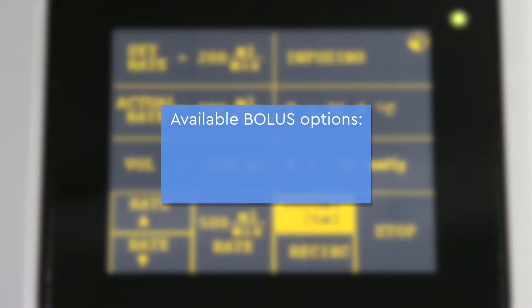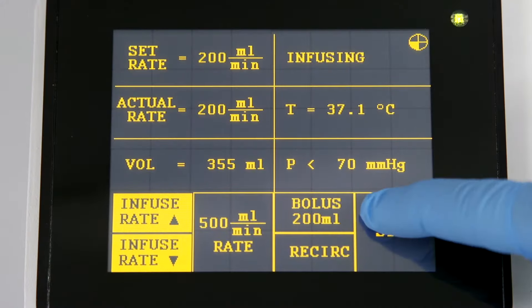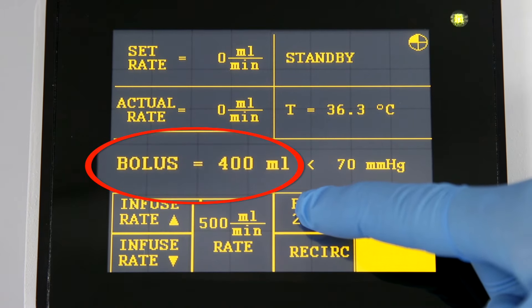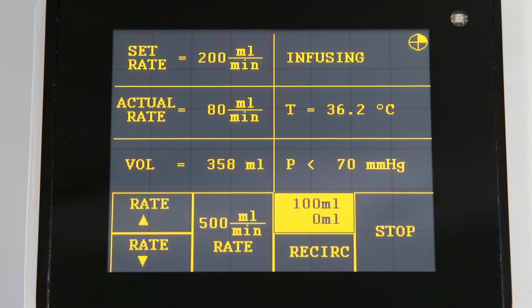Available bolus options are 100, 200, 400, 500, and 1000 mL. To change the bolus settings, press stop and then press and hold the bolus key to scroll through the different values. When the desired bolus volume is displayed, simply release the bolus key.